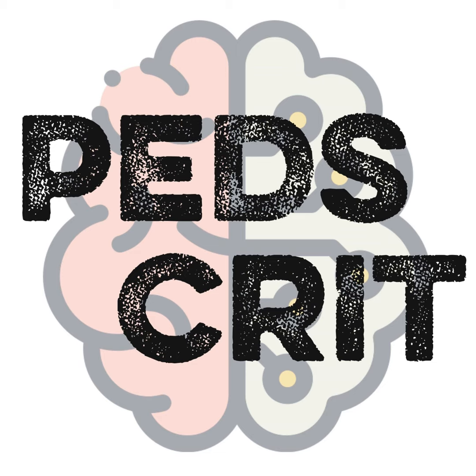Sure. So you can see that by looking at the rest of the organ function also, right? The kidneys have improved. Typically, at least in significant cardiogenic shock, we also see elevation of LFTs, so your LFTs are going in the good direction. And then you start seeing a good pulse pressure variation based on your arterial line. Obviously, if you think clinically he has made some improvement, we get an echo to see where the function is, and NIRS, lactate, all of your laboratory data. So it's a combination of lab values, recovery of organ function, improvement in the pulse pressure, and echocardiographic evidence. All of this helps us think that the heart is coming back.